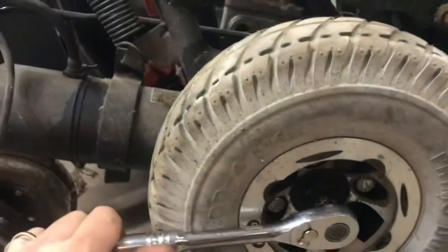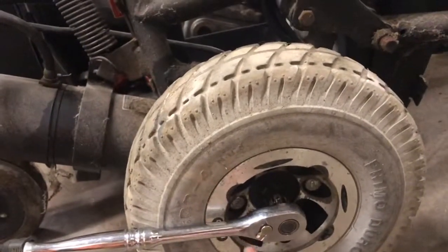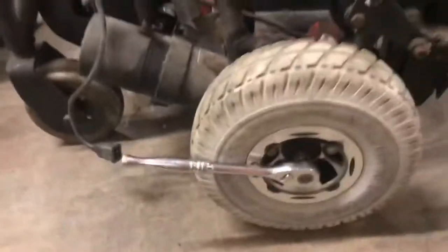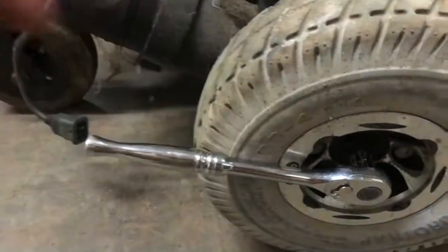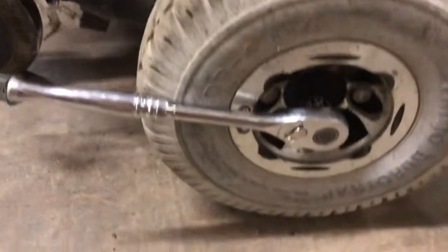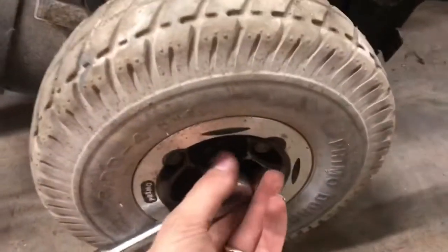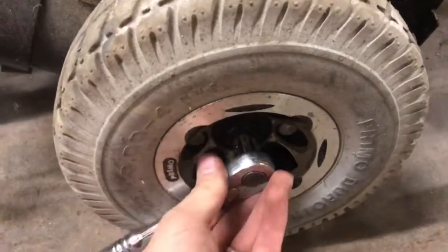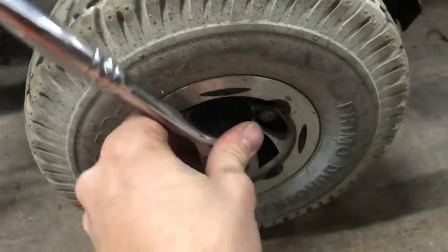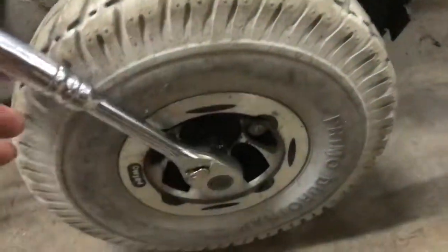So what I like to do, if it's really tight on there, is make sure the socket is on there really good. I usually put my foot on it and go as straight down as possible so I don't strip anything. But in this case, this is a little loose. And because my socket wrench is messed up, I'm gonna have to keep doing this until it comes off. Okay, it's actually almost off.